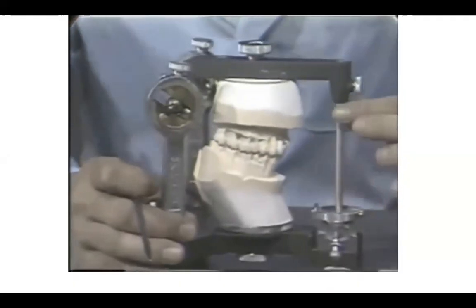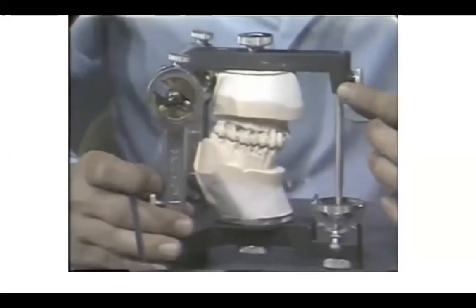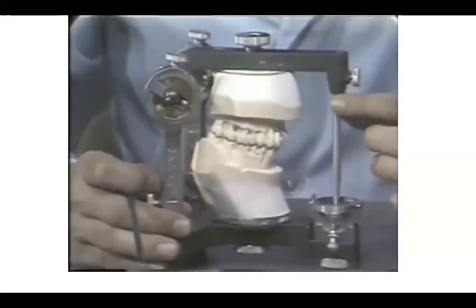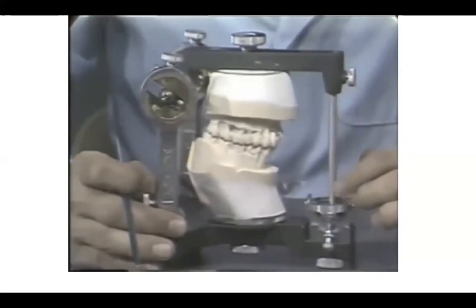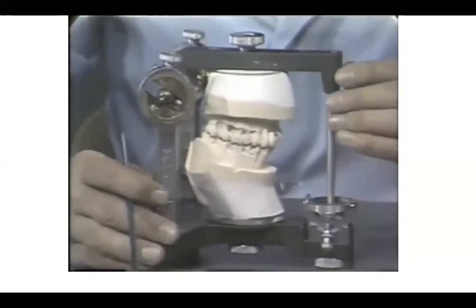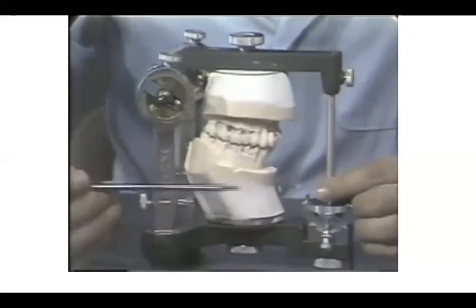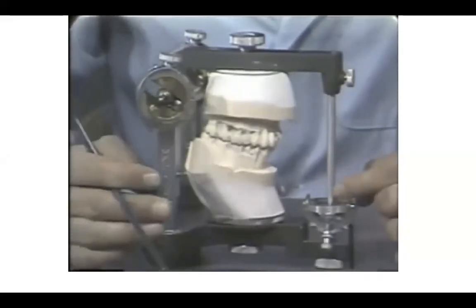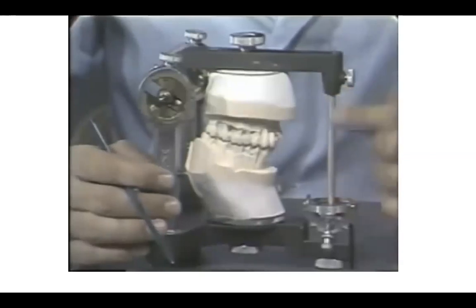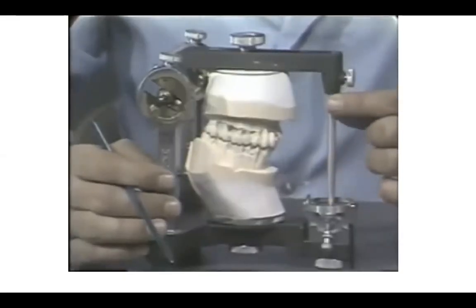The incisal pin is also attached to the upper member of the articulator, and its purpose is to prevent closing of the articulator if the stone casts, for example, start to abrade on the occlusal surfaces. The incisal pin helps to maintain the vertical dimension of the articulator. Without it in and without the cast in, the upper member of the articulator would collapse to the lower member.